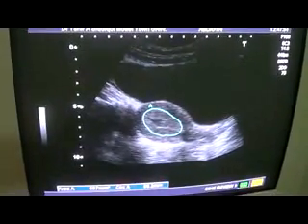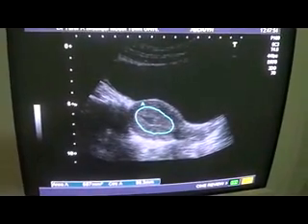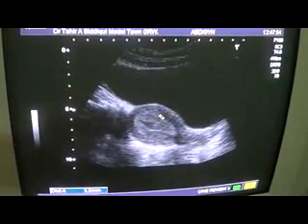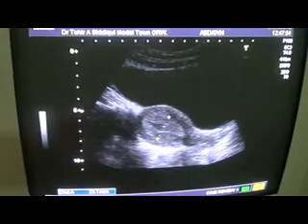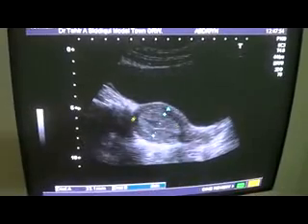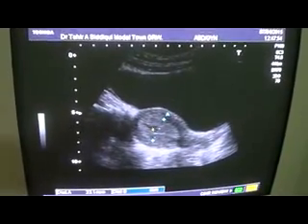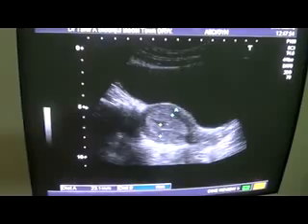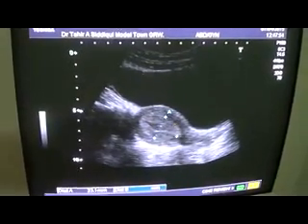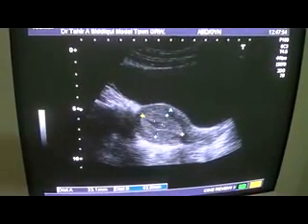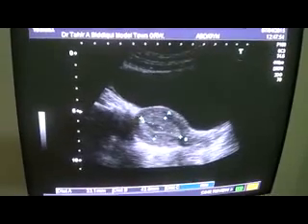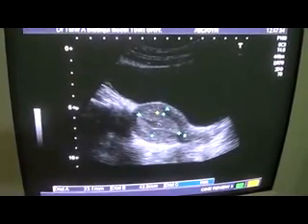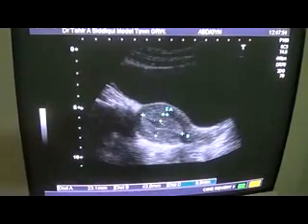Now what we see is that this encircled area — this one is the endometrial canal measuring approximately 23 mm, or 2.3 centimeters. Normal is 1.4, so there is a thick echogenic rim around the central anechoic area of fluid within the endometrial canal. The total measurement is 4.2 centimeters by 2.3 centimeters, with internal fluid. The echogenic rim is evenly echogenic.